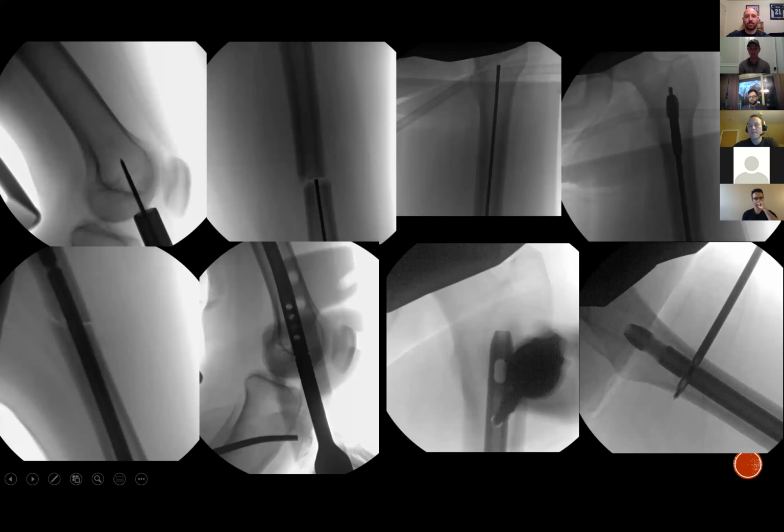through the shaft, let's look here for an opposite example. There is a ton of space in the proximal femur metaphysis. Those cutting edges and the flutes are not contacting anything other than soft metaphyseal bone. You won't hear anything here. But look, no, I thought I had a picture, but I don't.